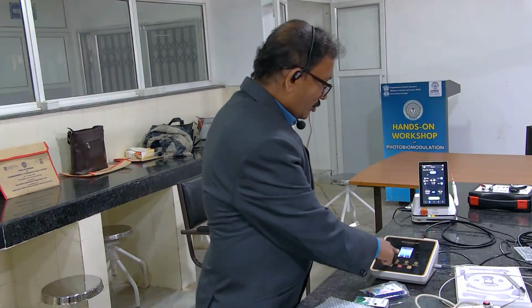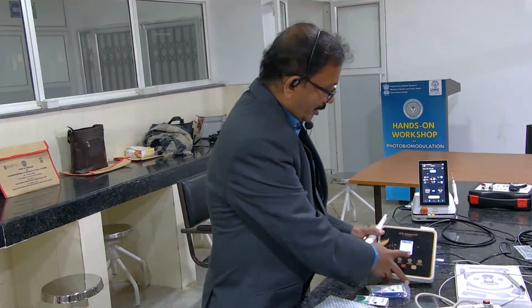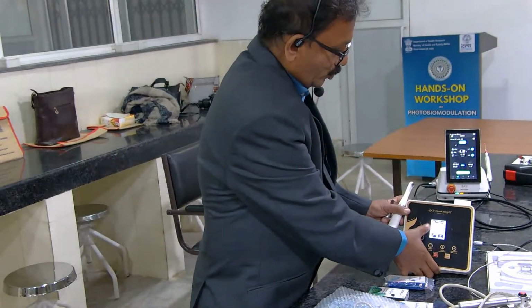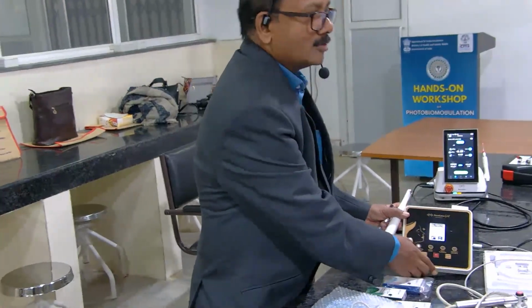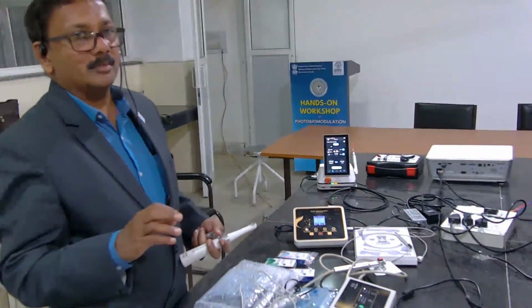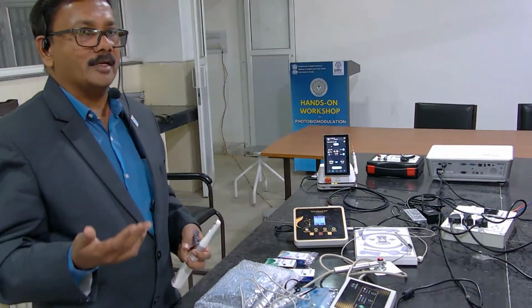Anything that is less than 100 milliwatts, जैसे अभी ये दबाऊंगा तो can you see here 100 milliwatts, I can increase it 200, 300, 400, 500. So photobiomodulation 500 milliwatts maximum you can. Anything that goes above the 500 milliwatts you are going into thermal zone.